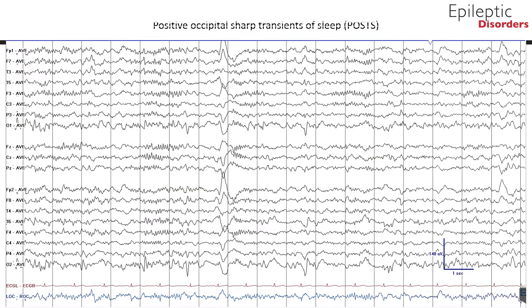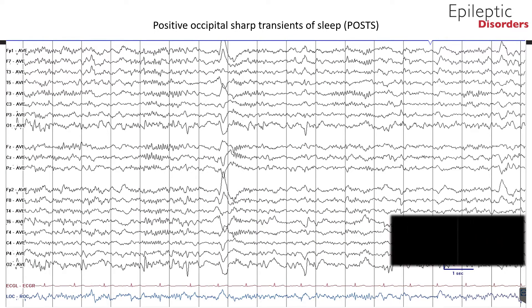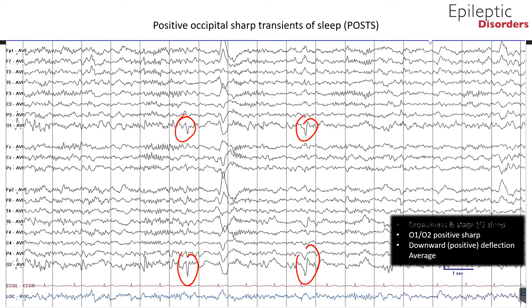This is the same EEG shown in average montage, and clearly here you can see positive deflections on the EEG best appreciated in O1 and O2 channels. They are positive, they are occipital, they are sharp, and they occur during sleep. Hence, the name POSTS.